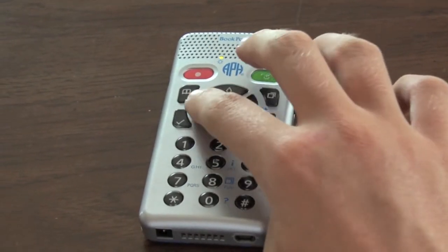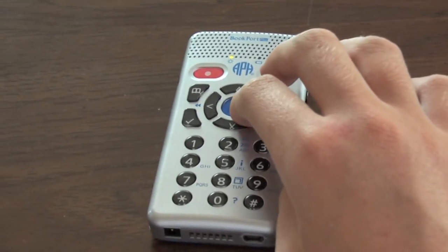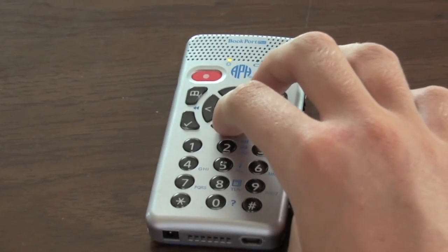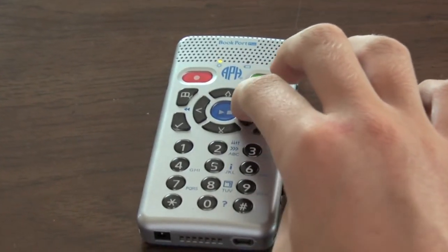So let's go back into the menus. System. This time I left arrow to system because I know it's the last menu choice. You could either use the right arrow and pass all the other options to system, or you could just left arrow, because these menus will wrap, meaning you can continue to cycle through them. They don't have a beginning and an end. Enter. Down arrow opens the system menu.